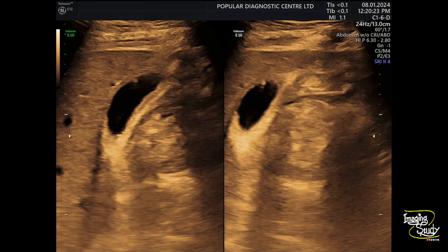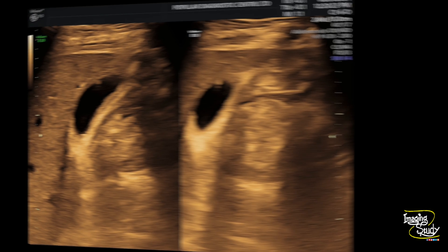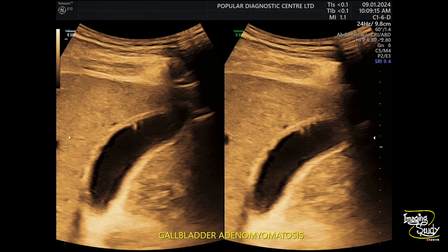Here is a picture where you can see the gallbladder wall thickening with a polyp-like area. On my first scan I was a little confused — this may be a case of a gallbladder polyp — but magnifying the image made it clearer. Here's another image and you can see at the same area there are some comet-tail artifacts coming from that focal thickening.